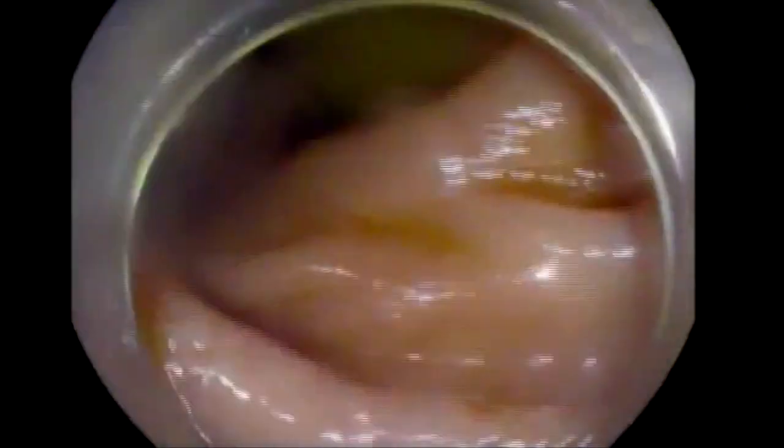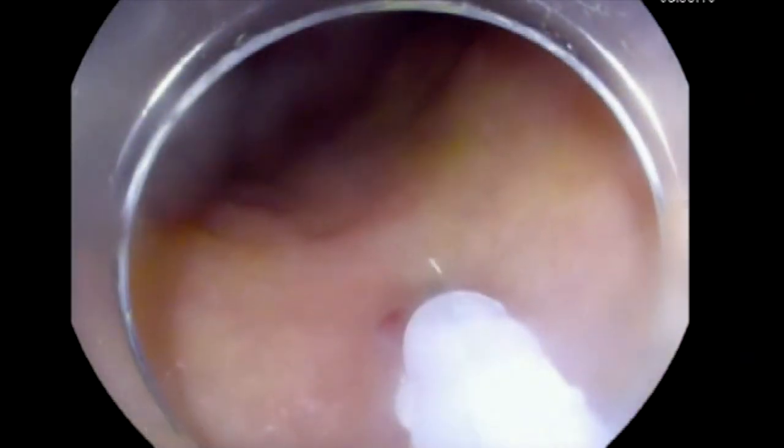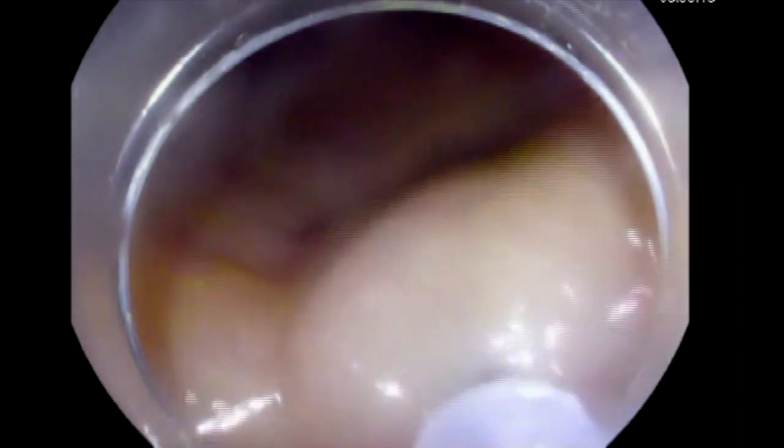This patient presented with nausea and vomiting after she had surgery for a hiatal repair. She responded to Botox, and was then referred for G-POEM.